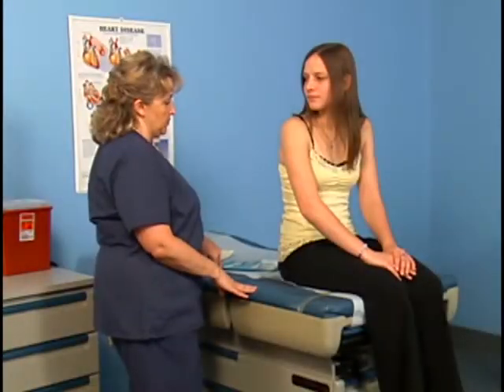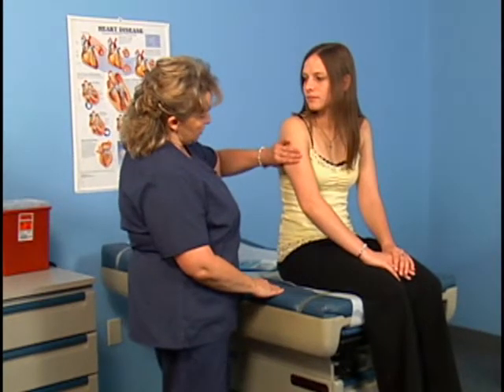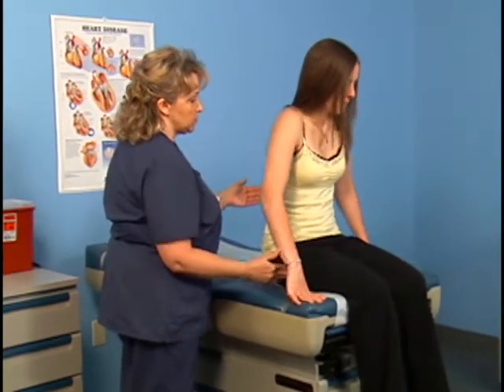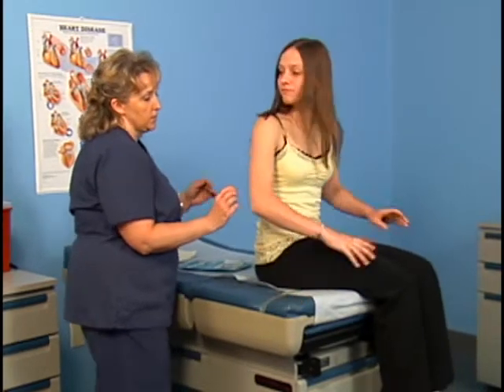So you're in for an allergy injection today, right? Yeah. Okay. And you've been getting these about 2-3 months now? Yeah. Select an appropriate subcutaneous injection site. Carmen's last allergy injection was administered into her left upper arm, so this injection must be administered into her right upper arm. Make sure the entire area is well exposed to ensure a safe and comfortable injection.